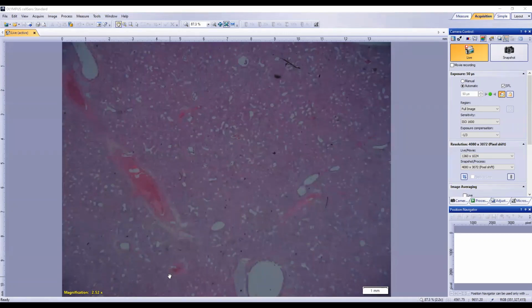Using descriptors, everyone pipe up, what would you be expecting to see within the alveolar lumen? Neutrophilic exudate, yep. So we'll get a mixture of eosinophilic material, exactly. Macrophages are a good one.